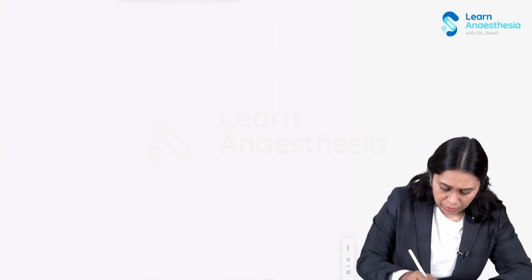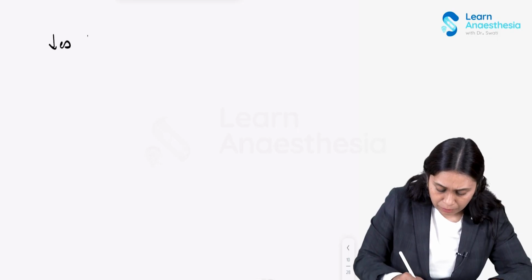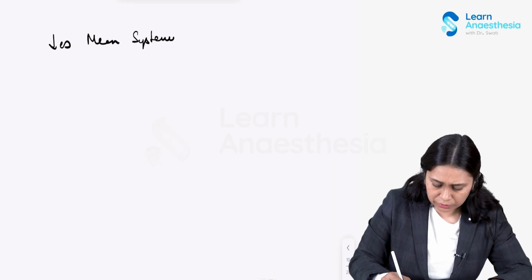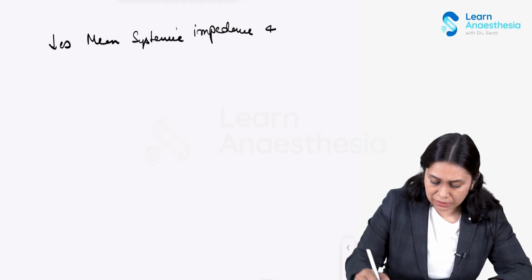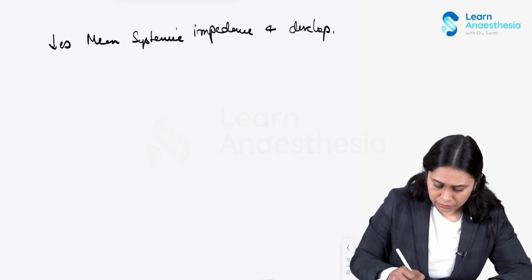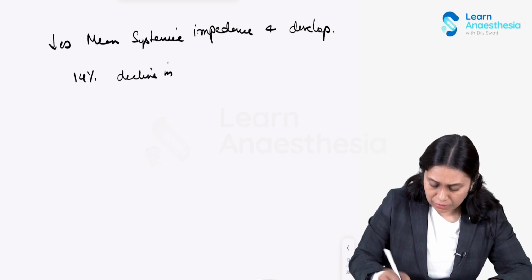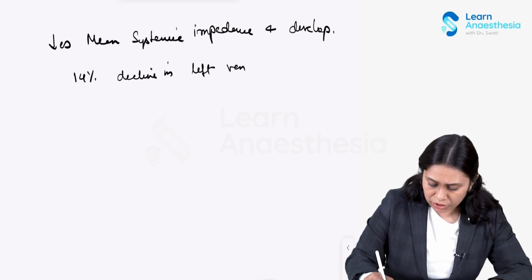Then it decreases mean systemic impedance, and there is, let's say, a 14% decline in left ventricular wall stress, right?